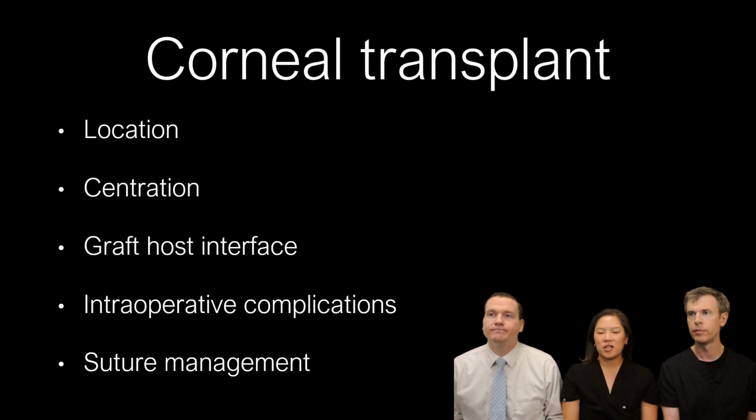Centration of the corneal transplant, so where it's actually transplanted, we just went over care, so that's technically a peripheral corneal transplant. The graft-host interface, which is especially important for you with the contact lens fitting, and then intraoperative complications, always fun for us, and then suture management, always fun for everyone.